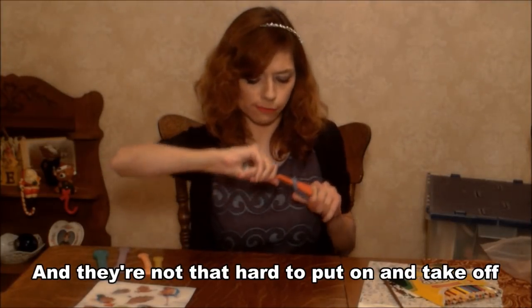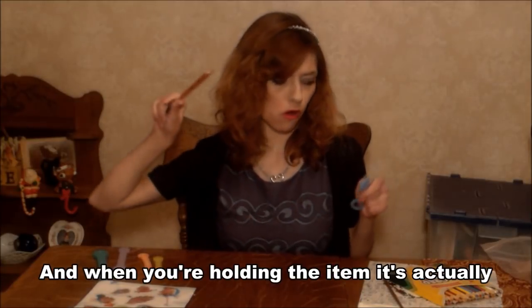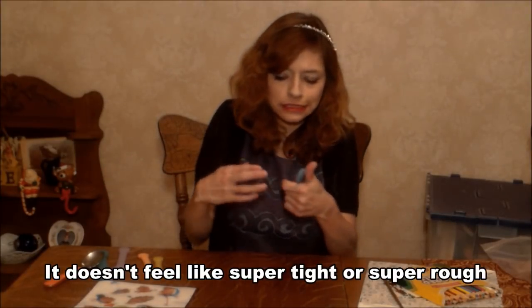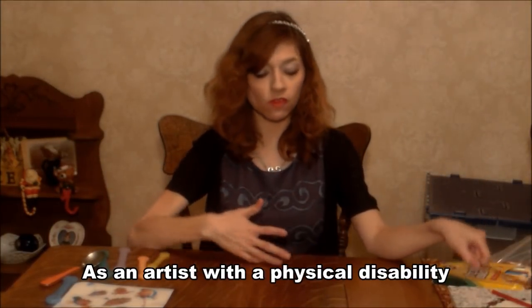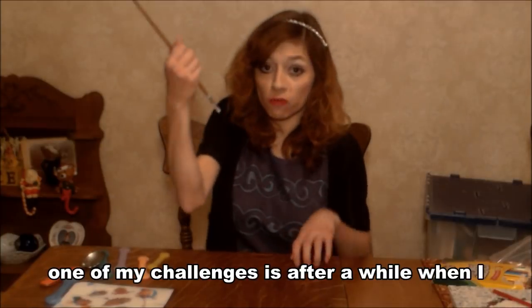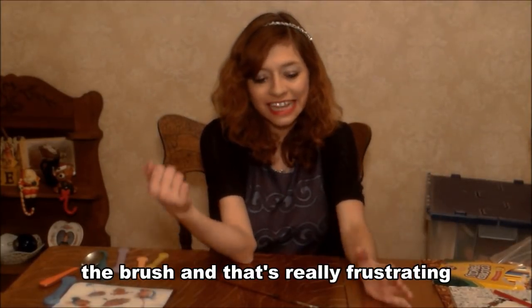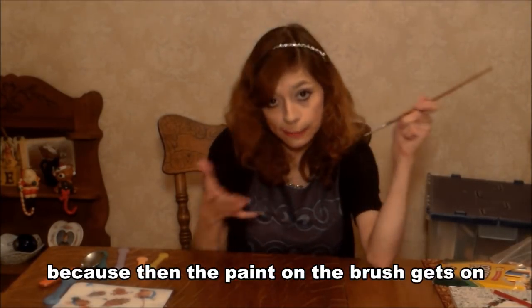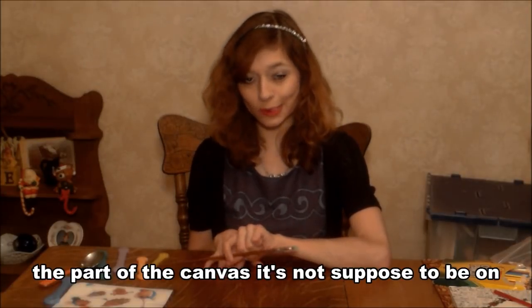And they're not that hard to put on and take off. And when you're holding the item, it's actually really comfortable — it doesn't feel super tight or super rough. As an artist with a physical disability, one of my challenges is that after a while, when I paint, my hand tends to let go of the brush. And that's really frustrating because then the paint on the brush gets on the part of the canvas it's not supposed to be on.